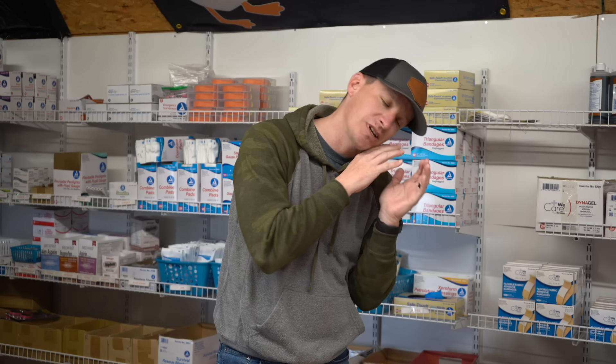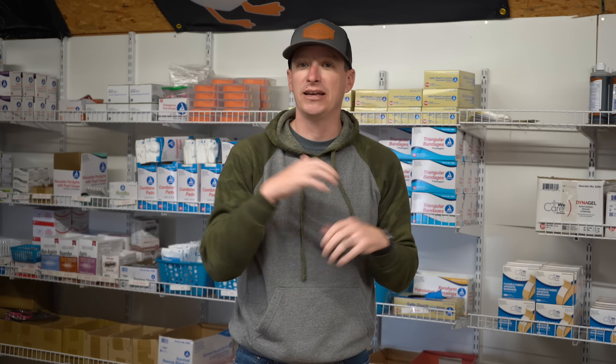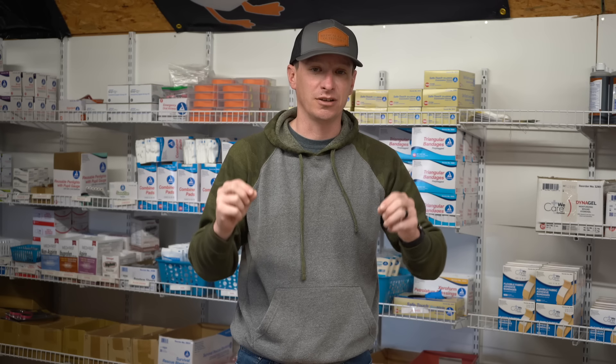All you have to do is put them in the recovery position — lay them on their side. This will take the tongue off the back of the throat and we're clear. NPAs come in many sizes, from size 22 up to about 32, covering child, infant, adult, and large adult. So there's a wide range.